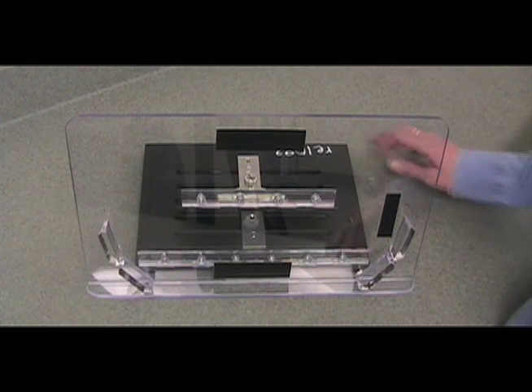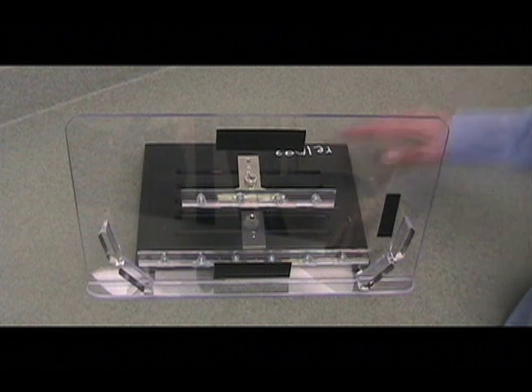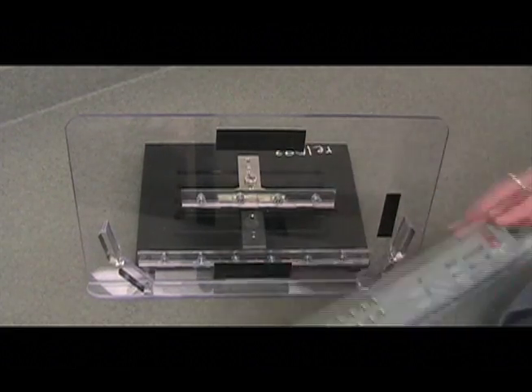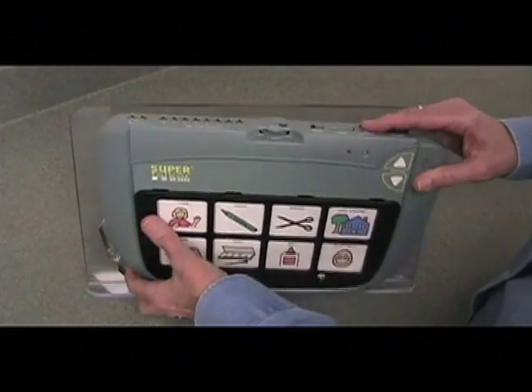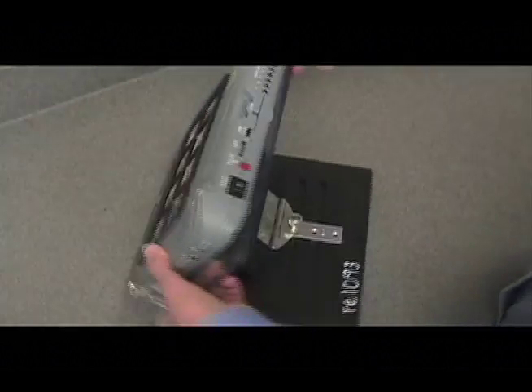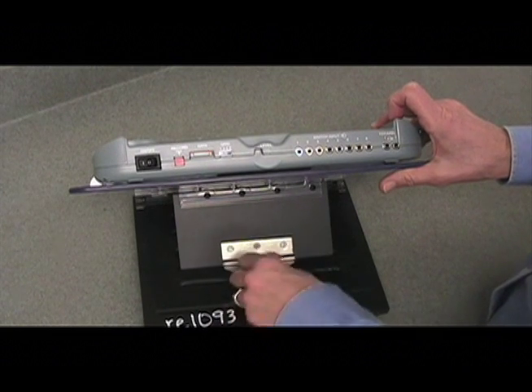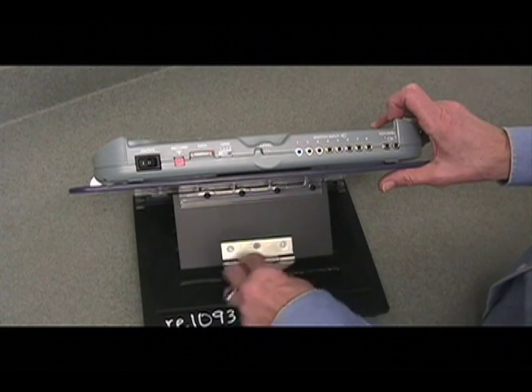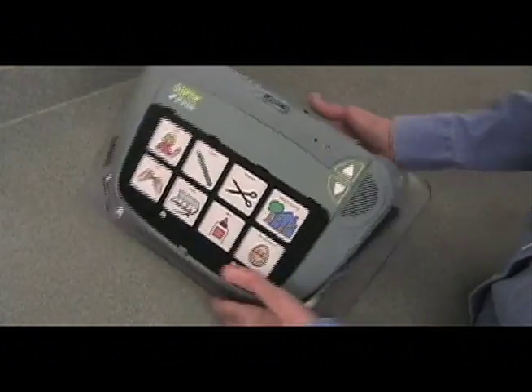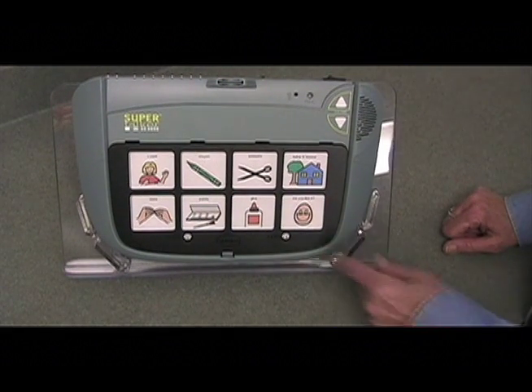An accessory that is available for the SuperTalker is the adjustable stand. The SuperTalker attaches to the stand with strips of velcro. And the angle of the stand can be adjusted by placing the brace in the slot that holds the device at the angle that you want. You tighten that screw to secure it. Then you have your device in a very nice secure position for the user.